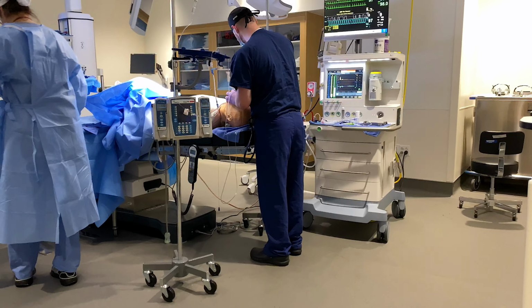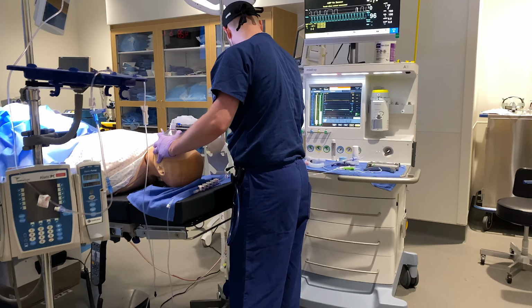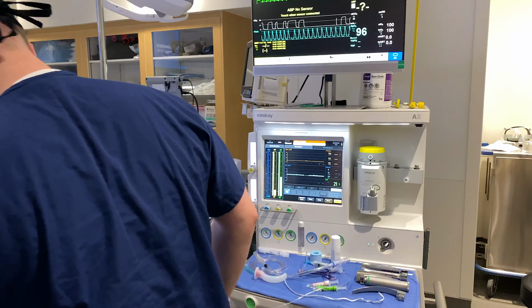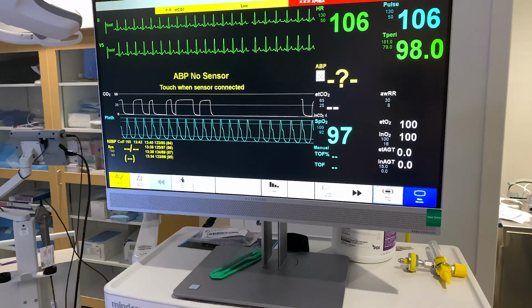Each year during Vapor Camp, the rising CA1 class comes to the Sim Lab for an entire week and spends the week with us participating in a variety of high-fidelity scenarios. Our goals are to teach them how to manage hypotension, hypertension, tachycardia, bradycardia, and hypoxemia, and go over basic algorithms to manage these crises.